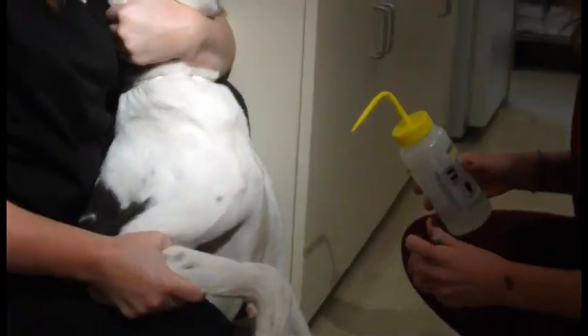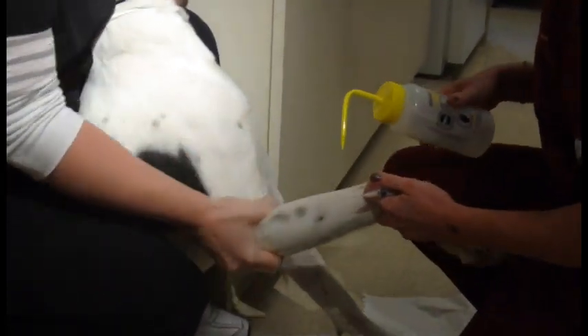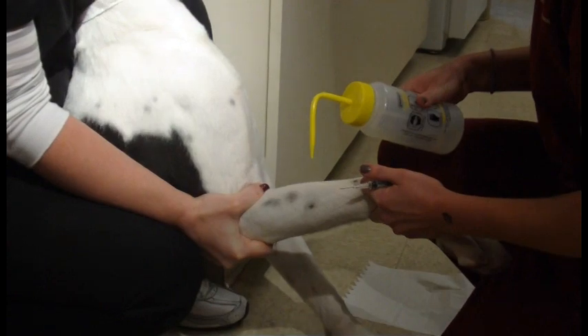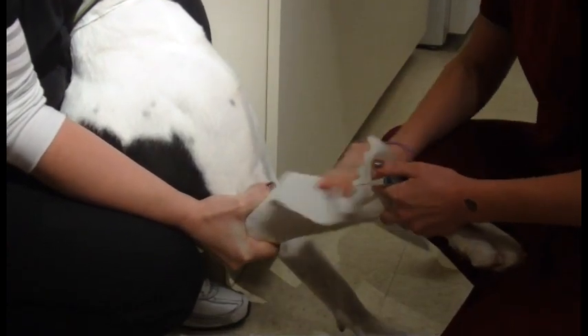What we're going to be doing is performing a cephalic venipuncture on Marmaduke here today. Right now what the students are doing is getting their needle ready and selecting the site they're going to be using. We're putting some alcohol in there to sterilize that area.